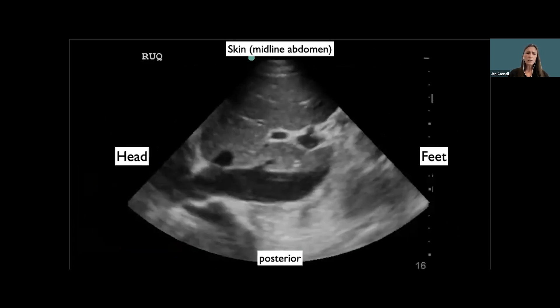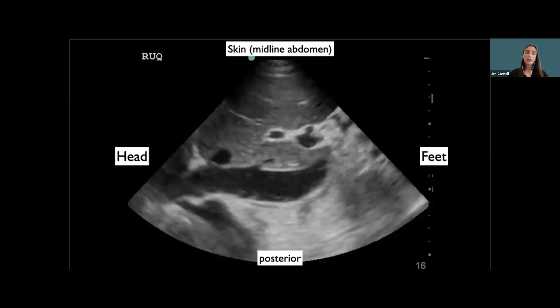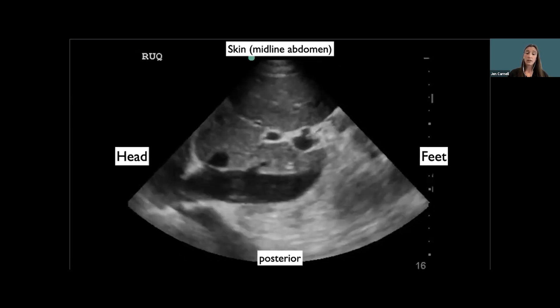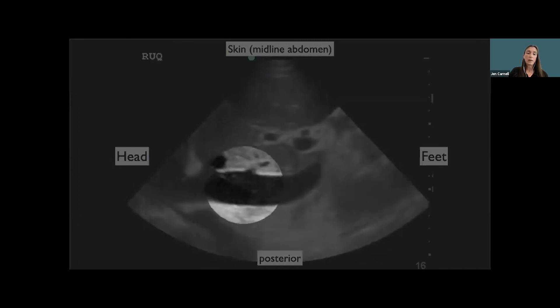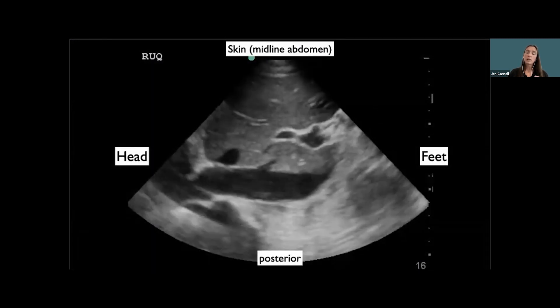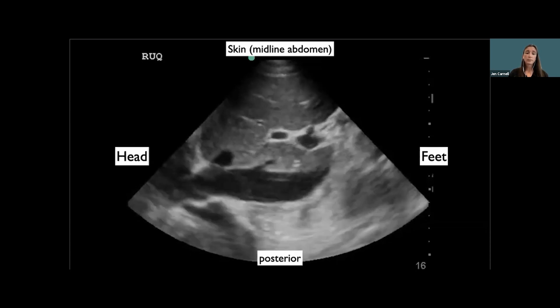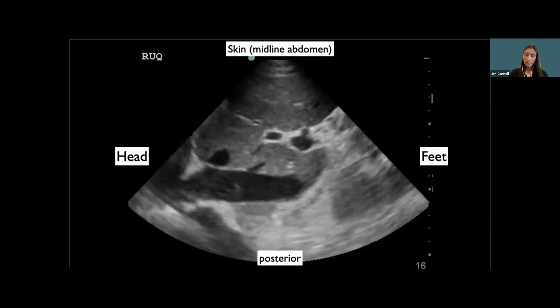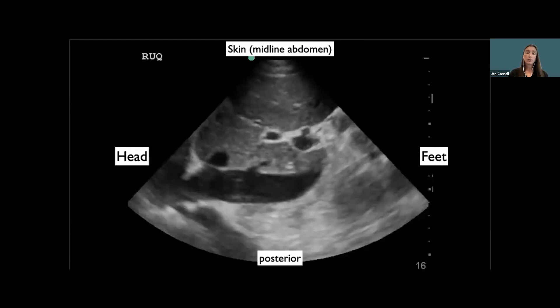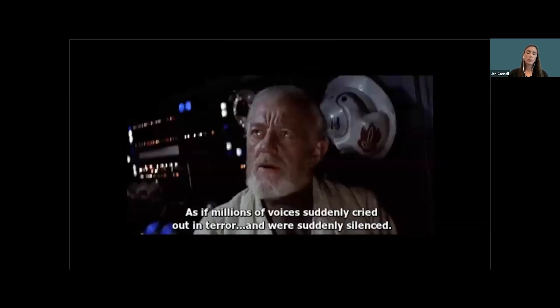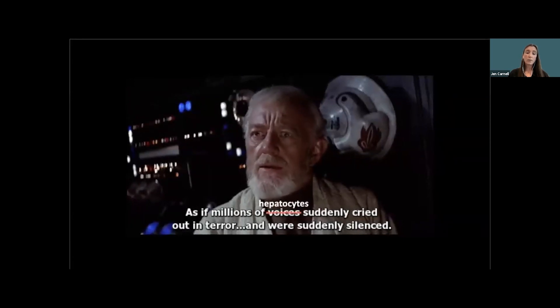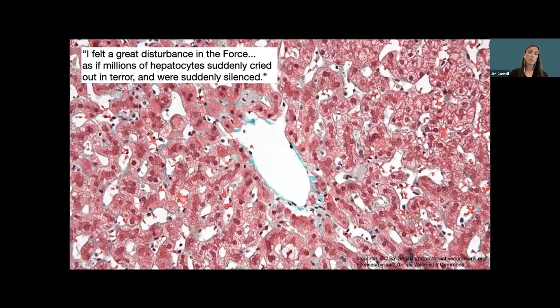Why does he have right upper quadrant pain? When the left ventricle isn't pumping well, you get a congested, plethoric inferior vena cava that's dilated and doesn't vary with respiration — that's abnormal. This speaks to hepatic congestion, and that hurts. The hepatocytes are congested, the liver capsule stretches, and the right upper quadrant starts to hurt. I have seen this countless times as the presenting symptom in new heart failure.